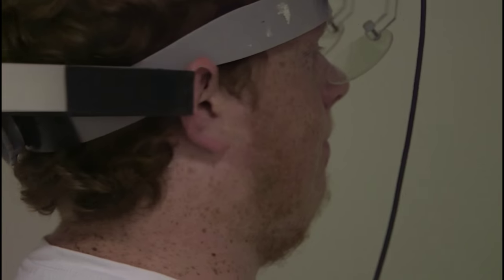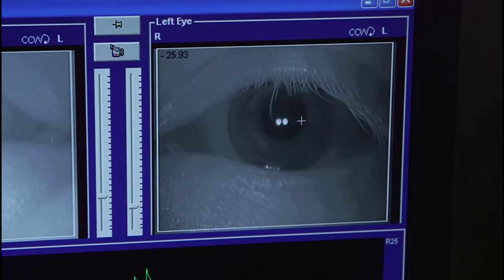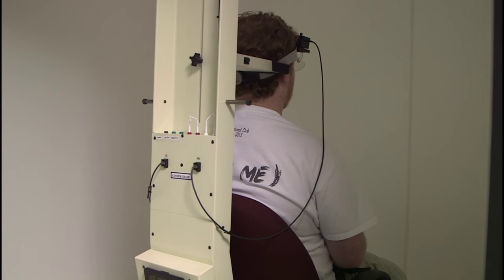Just like the VNG test, patients will wear goggles that monitor their eye movements. Typically one of two things happens: either the rotary chair will oscillate back and forth, or the rotary chair will spin in a complete circle for about 45 seconds and then stop, and then spin in a complete circle for about 45 seconds in the other direction.